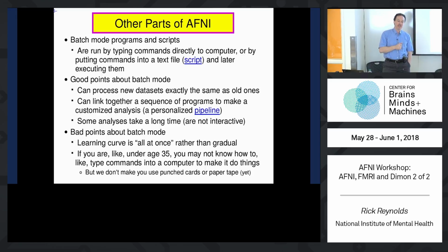We just recently replied to one of Tom Nichols' preprints of some analysis, and along with our reply to that, or pre-ply, I don't know, we included examples of a full processing analysis, everything. So we've recently redone an analysis with a complete set of scripts, so you can use something like that as a sample starting place. But how do you learn all the individual programs? Just practice. Practice makes better, right? So do so.